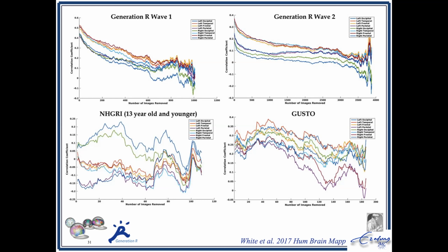Going a little bit deeper, Pradeep, I agree with Tonya. Her measurement of quality is, even though it's the same image, somewhat independent of the FreeSurfer cortical thickness. So she's just looking at the relationship between them. That's my understanding. Yeah, so I am yet to believe that, so to say. I'm not saying this is all wrong, but I don't think FreeSurfer cortical thickness values in these ROIs track the original quality of the input T1 MRI, because even in, go ahead.